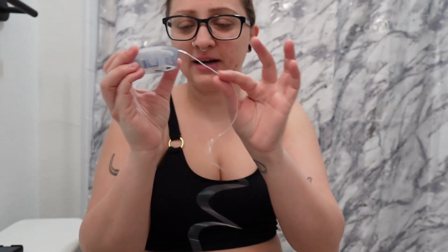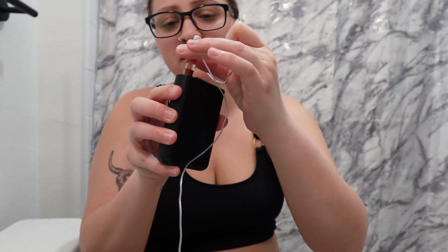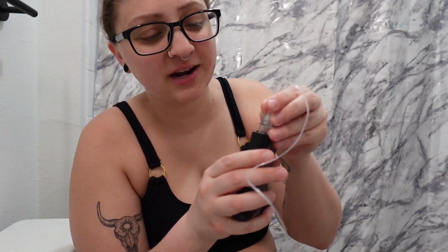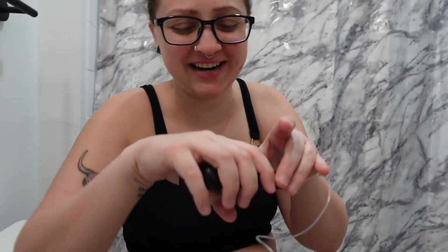So we're gonna go ahead and take the inset out. I'm gonna go ahead and lock in the little connector. We're gonna drop in the cartridge, and then to lock it, we're just gonna set the little wing, if you will, sideways, push down all the way. Once it's flush, you can then turn it like a turnkey almost to have the wing towards the screen.